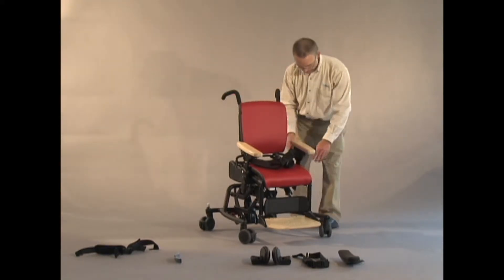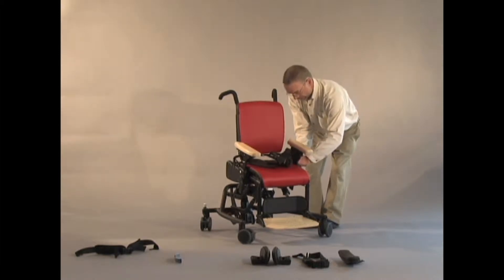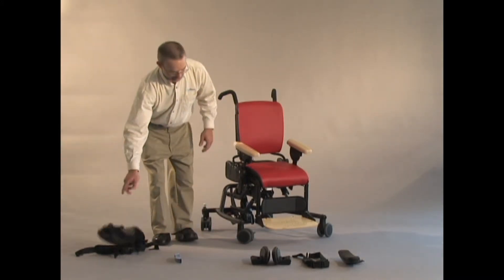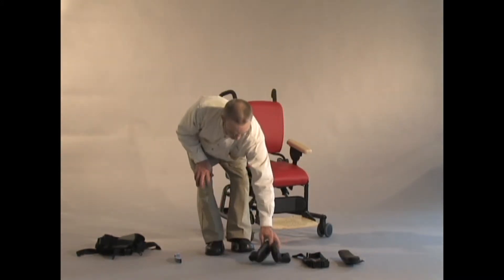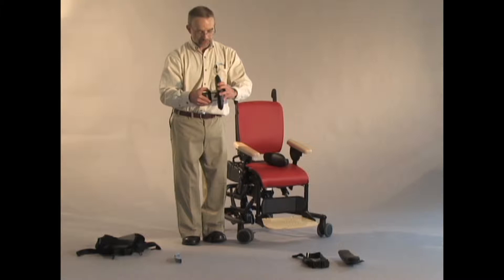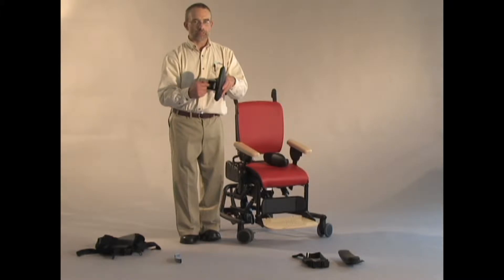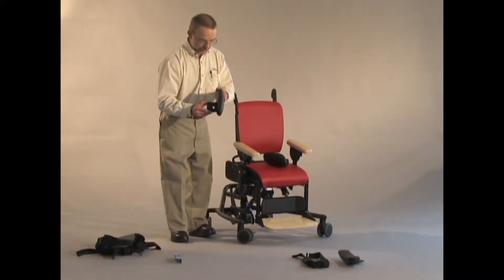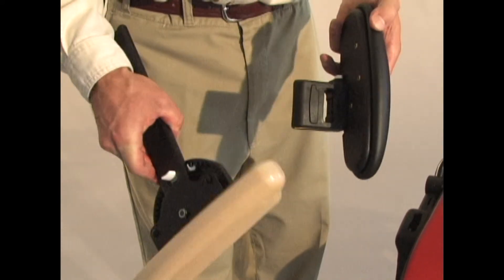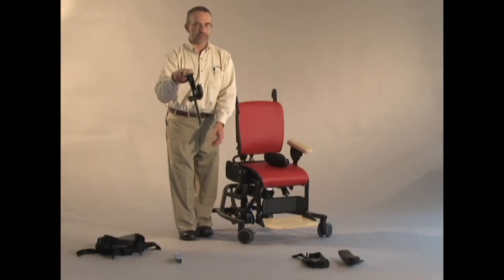For pelvic positioning laterally, we are using what we call our hip guides. The hip guides have white buttons on them. This white button here, I adjust the lateral width of the hip guide, and you'll also see the outline of our armrest engraved into the mold. That should help you get the hip guide onto the right armrest so you don't get rights and lefts or front to back mixed up. So the hip guide will actually live on the armrest.